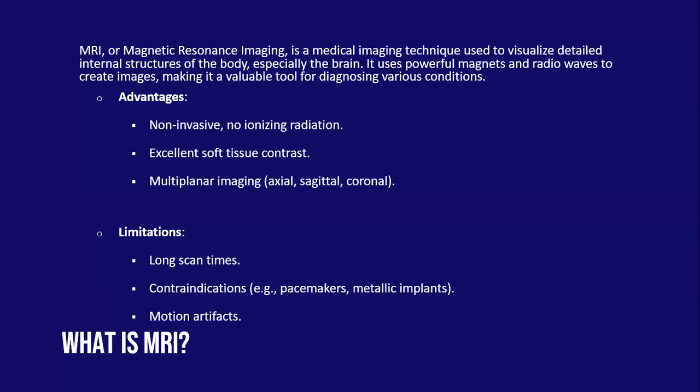So the basic principle of MRIs is that you have a very powerful magnet. That's why patients who are going in are advised not to have any metallic objects on them. You don't go in with any oxygen tanks, and patients who have pacemakers, as an example, can disorient the pacemakers.